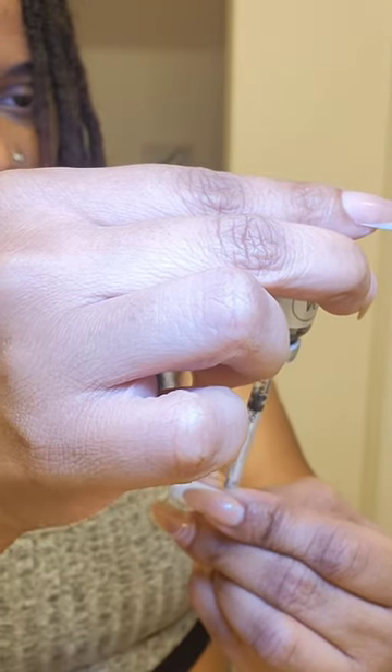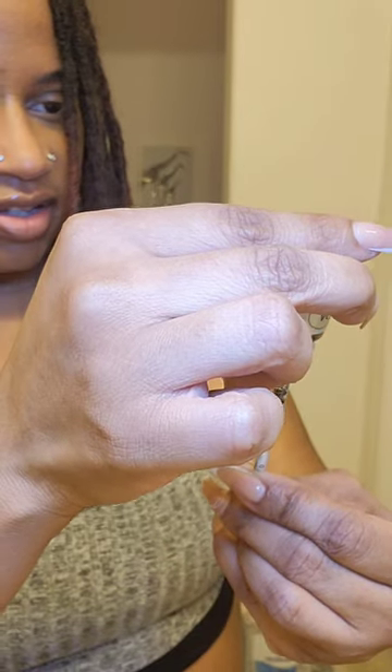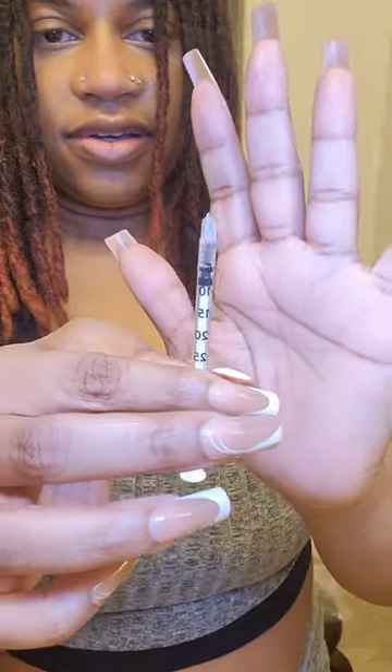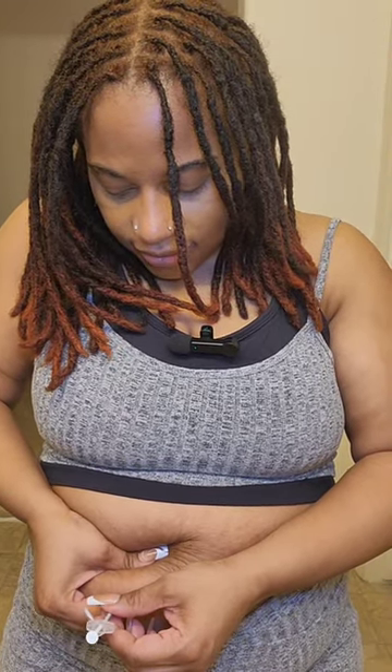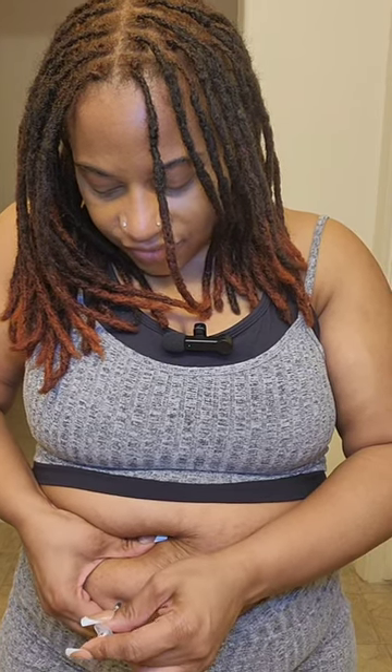A little bit more. Alright, I'm gonna wipe the needle here and do the second injection. Neither one of them hurt though, really — it's just a little pinch.